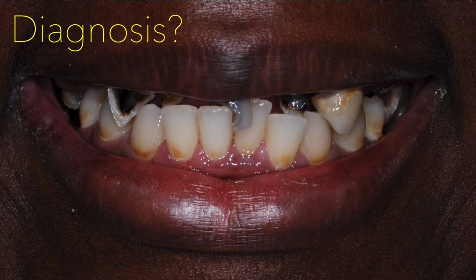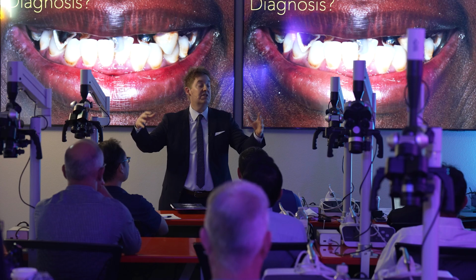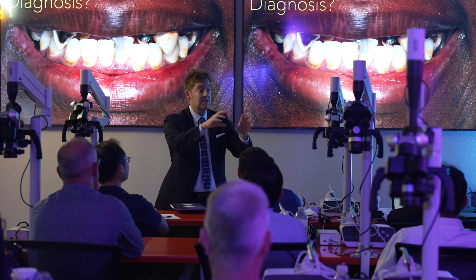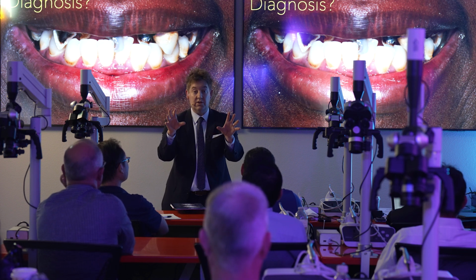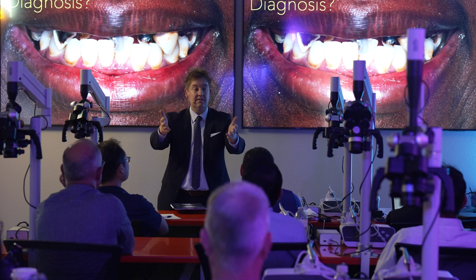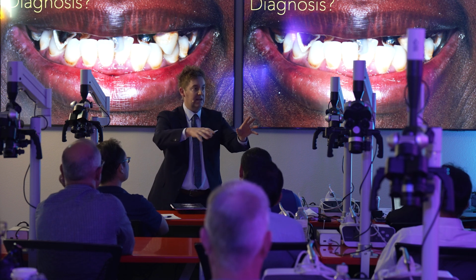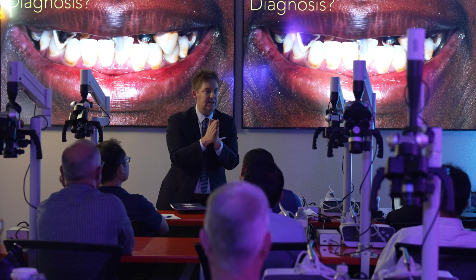Can we diagnose and evaluate patients better by clinically evaluating them or by looking at photos? I'm going to tell you photos. We do several photography and videography programs where we talk about the cameras and the lenses and the flash and the images and how we set the cameras up to get the images. And I teach a lot of occlusion courses, and I always show images and ask everyone in the audience to help me treatment plan the patient. And they all get to this: we're going to do this because of these wear facets, we're going to open the vertical. And everybody says, we're going to do this full mouth rehabilitation.